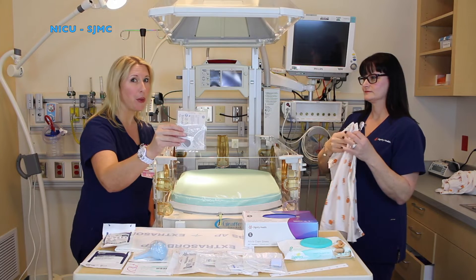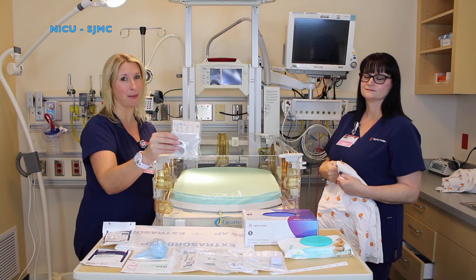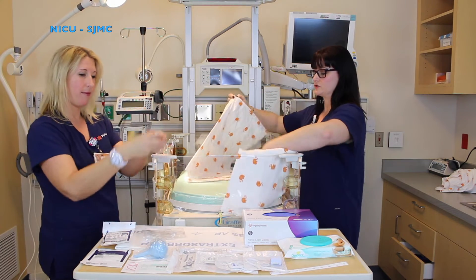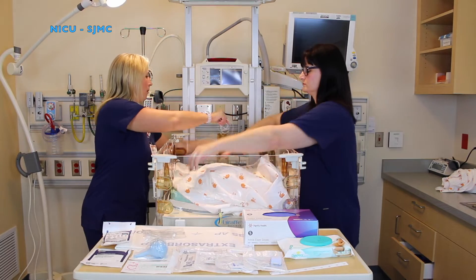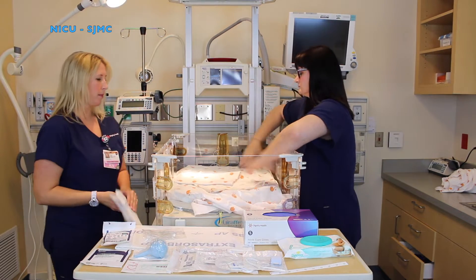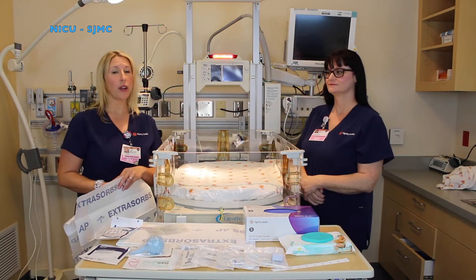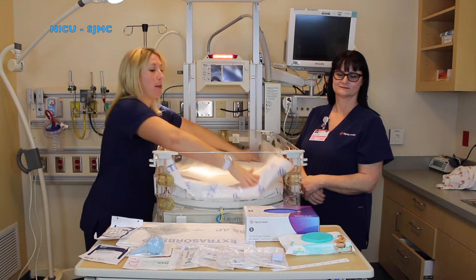Grab your giraffe temp probe and hook it onto the bed. This will tell you what the baby's temperature is and be controlled at all times. Next, you can take two clean blankets and place them on your mattress. Once your blankets are ready, you will place a chuck pad on top of your blankets to prevent a mess during the admission process.